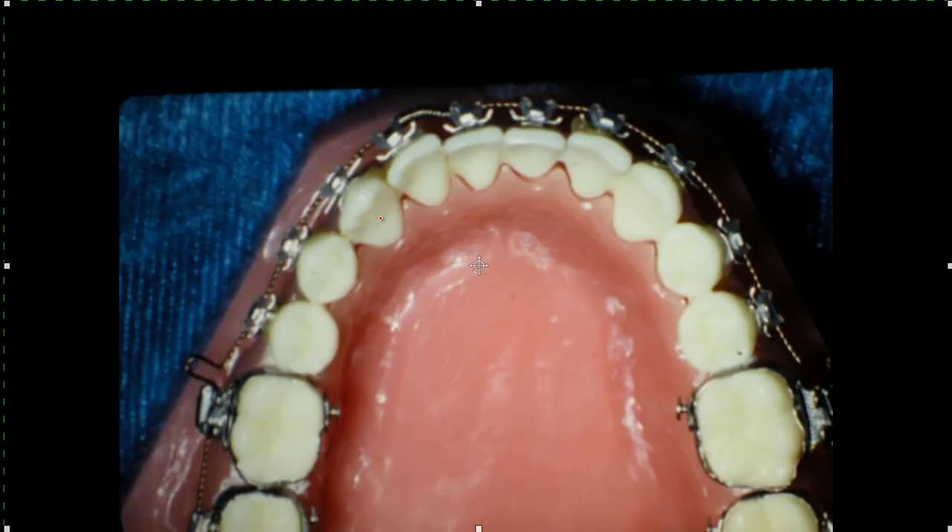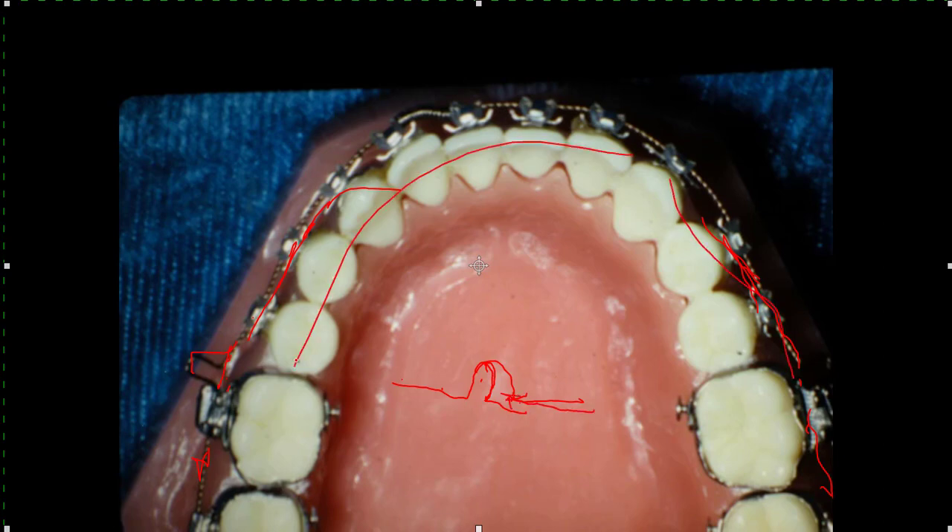There's that flexible wire on here. If we want to expand the arch, we'll have this loop real big and squeeze it down so the wire itself is pushing out from this loop - it's trying to push these teeth outward and the molars in this direction. That little wire made into just a little loop like this, when you compress it down to where it's kind of like that, it's got some pressure expanding the whole arch.